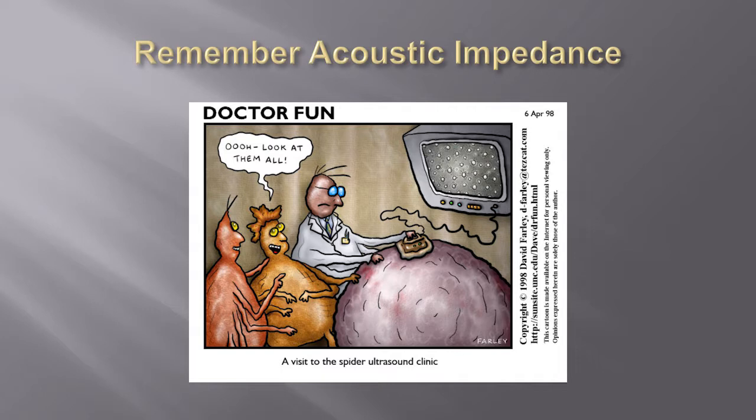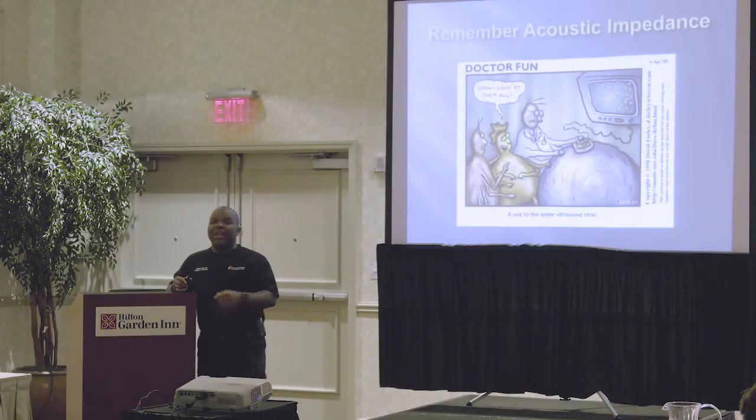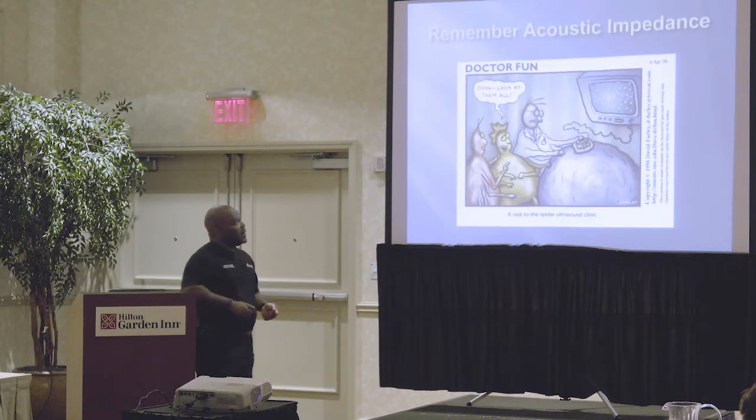Again, don't forget your acoustic impedance. Those are the things that are gonna get in the way of your image, and you wanna reduce them as best as possible. The one that you control is air. You control that by putting more gel on the patient. So you can't just lick the transducer and start scanning the patient. You're not gonna get a good image. And you probably shouldn't lick the transducer anyway.